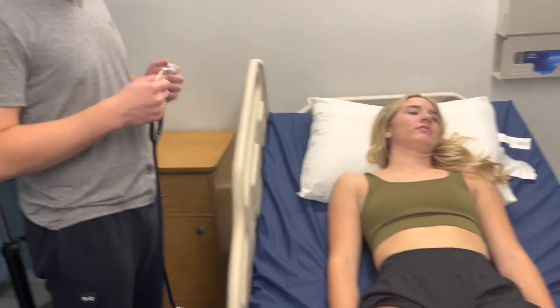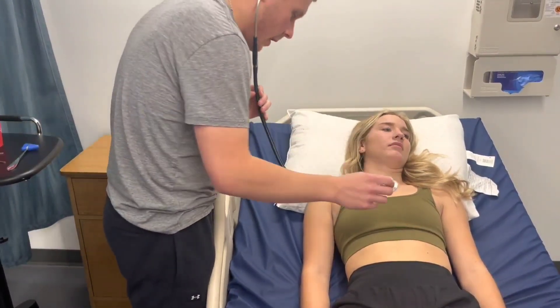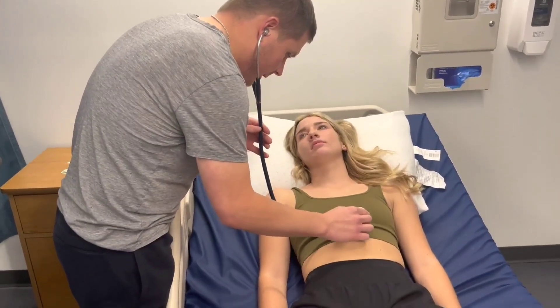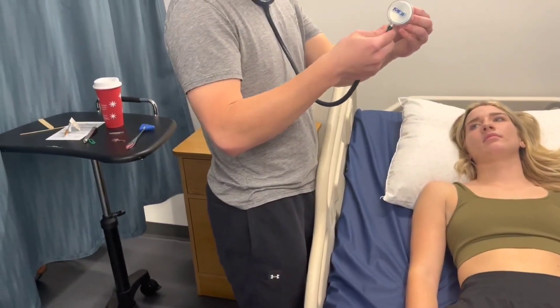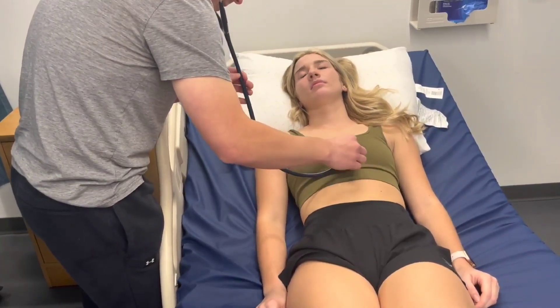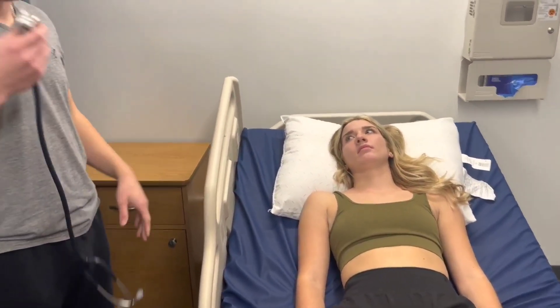I'm now going to listen to the heart in a Z pattern. There are five locations, starting with the diaphragm: aortic, pulmonic, Erb's point, tricuspid, and mitral. Then back: tricuspid, Erb's point, pulmonic, aortic. There are no adventitious heart sounds or murmurs present.